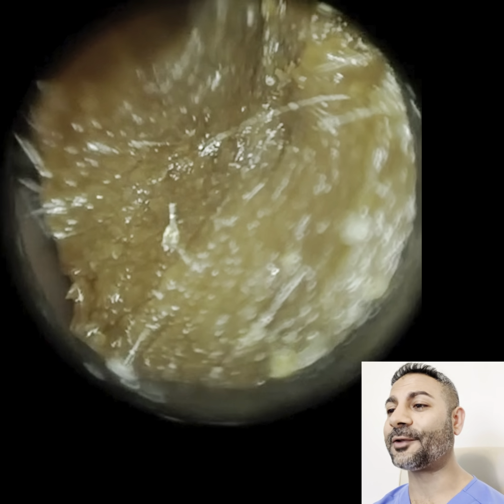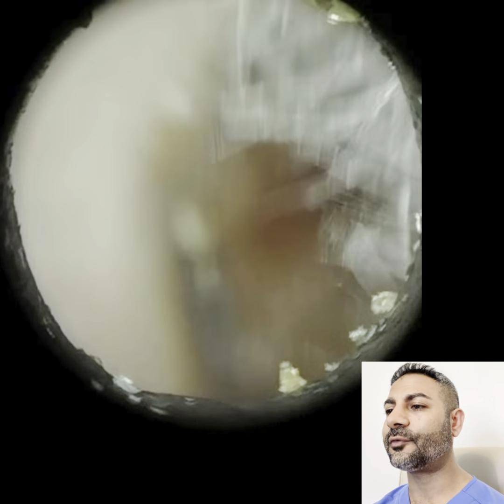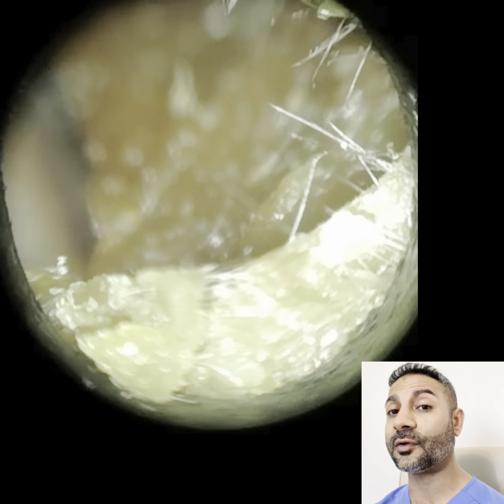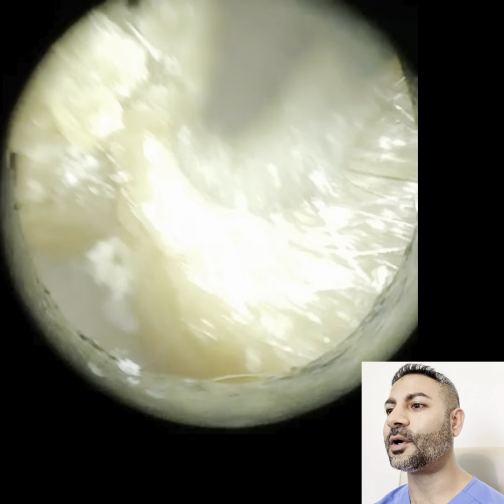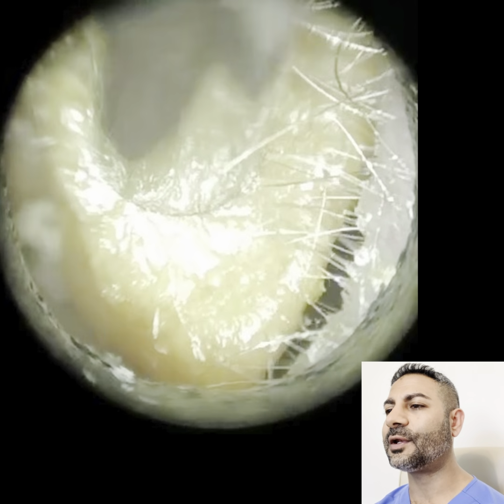So there's a lot of wax. You may have seen the intro video to it. So that was the left and right ear. I kept them separate. I think the wax on the right-hand side of the tissue was their left side. In fact, this is their left ear, but the right ear is even worse. So again, a bit of hardened wax keratin, quite reflective.